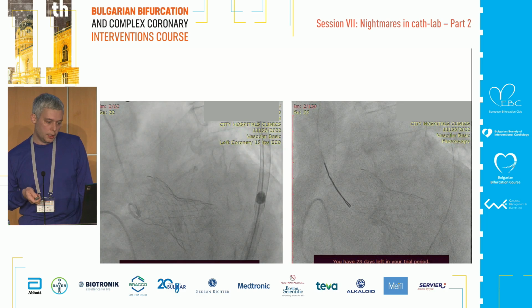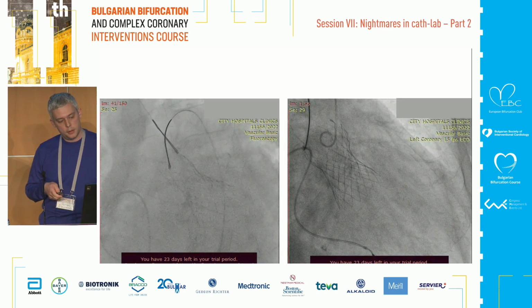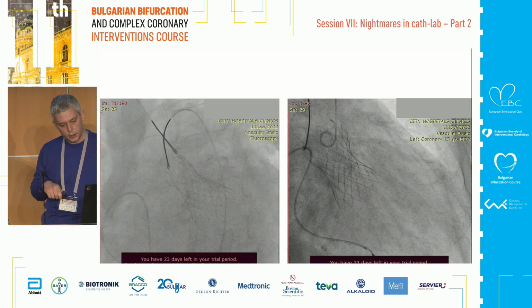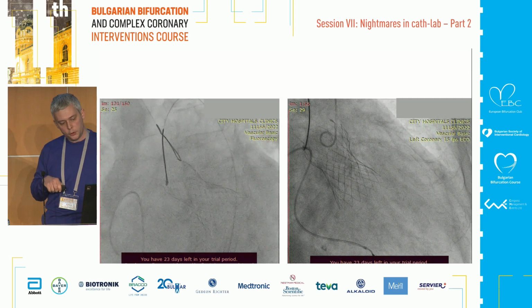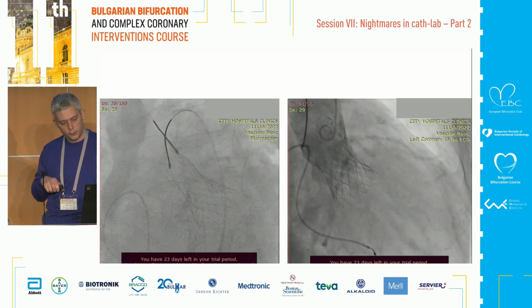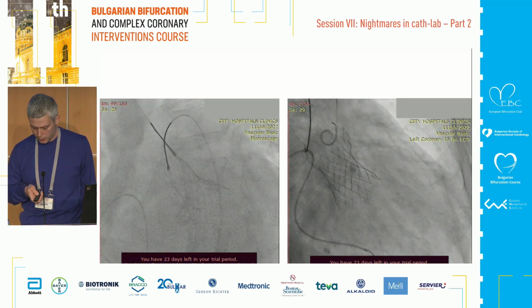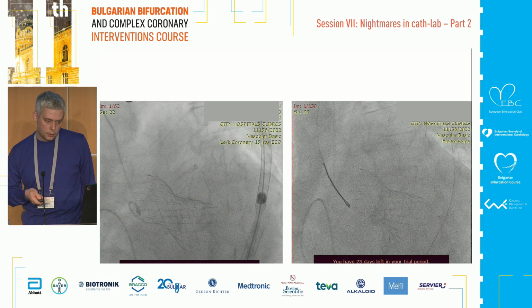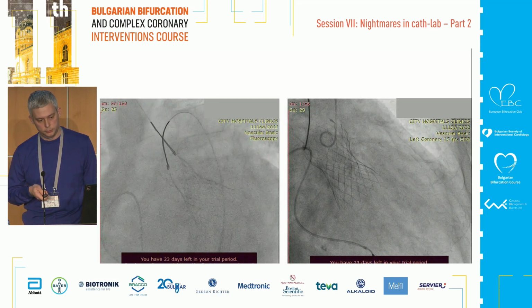So what we did was, with 2 Amplatz gooseneck catheters, make a traction up to rapid pace. We made the traction up to visible movement of the valve, then stopped and checked the aortic regurgitation, which is, in this case, acceptable.